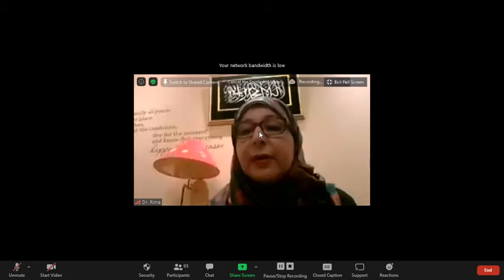Now again, we go more and more, we see a very small aorta, and then we take the ratio between the aorta, which is very small, and the pulmonary artery, which is very big. So the right ventricle is very big, of course, and the pulmonary artery is also very big because the other ventricle is hardly in action. So we have RV big and pulmonary artery big, and LV small and aorta small as well.